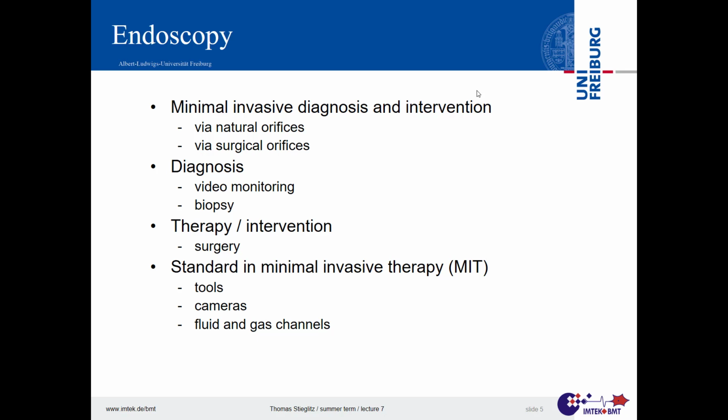The question is, how can you design a technical tool with which you can feel that? It's not only about imaging. Sometimes tissues have a different mechanical strength. You can feel that, but if they undergo imaging, they have this similar content of water or similar acoustic impedance or whatever, and it's really hard to see that in an image. Therefore, that haptics and feeling is still an issue.